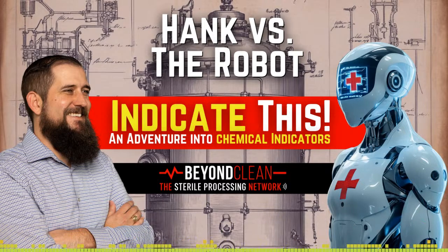Think of indicators and integrators like athletes in training. They perform better when tested in the toughest conditions. If you place them in easy spots, you're not getting a true read on whether the sterilization process is up to par. That's why we say load it right or fight the bite, because the stakes are just too high to leave it to chance.